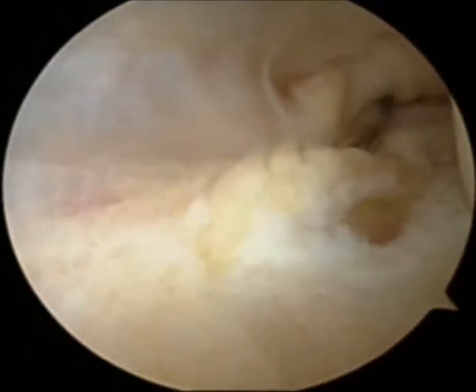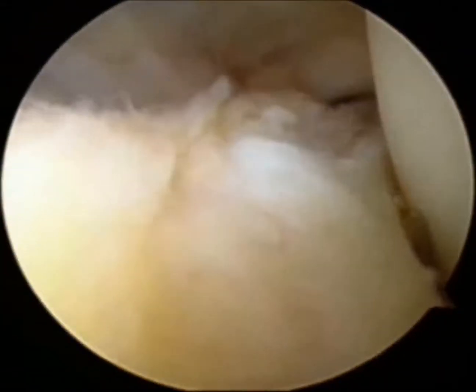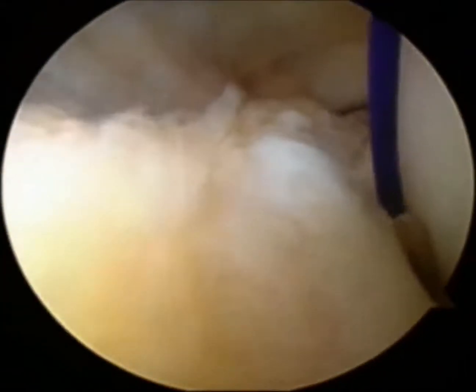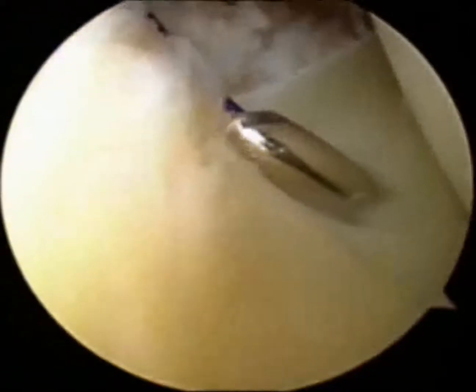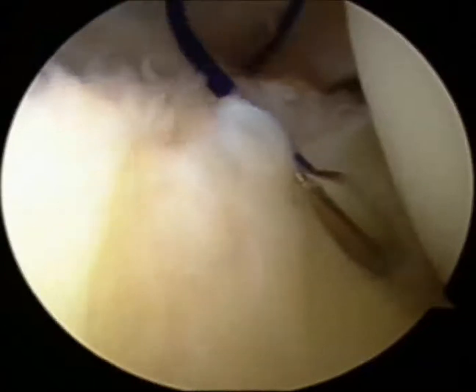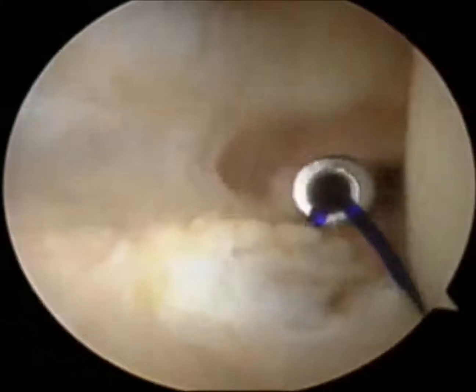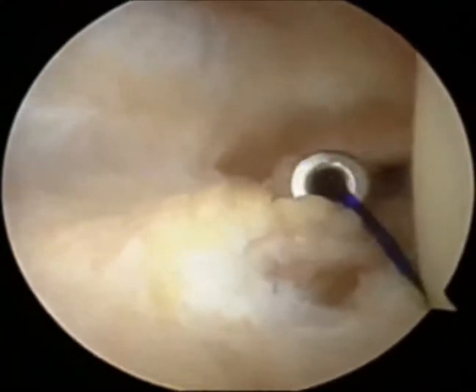With a 70-degree arthroscope routed through the anteromedial portal, visualizing the popliteal meniscal fascicle tear, we maneuvered the curved suture hook with a PDS number 0. The PDS number 0 was then passed up through the tear area from below, after which a suture retriever was used to retrieve the upper leg of the suture via the posterolateral portal.